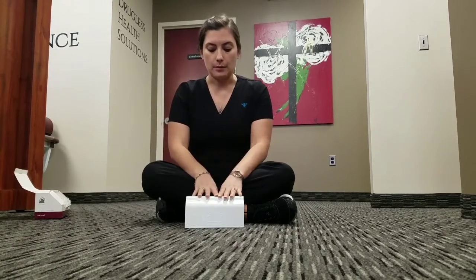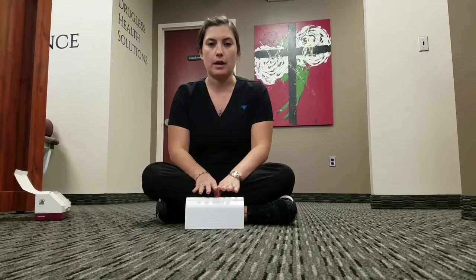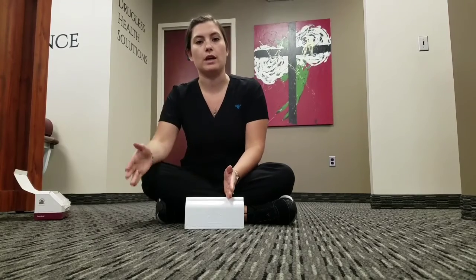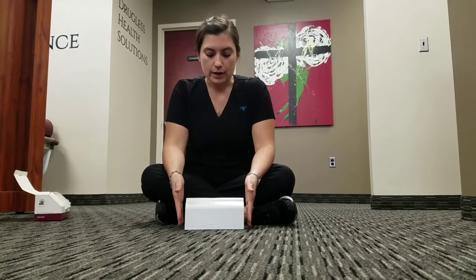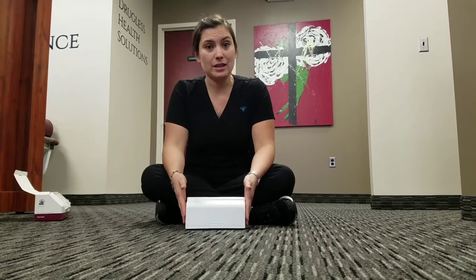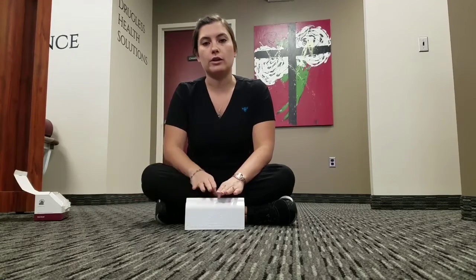Lastly, I know I said when you are increasing from 30 seconds and moving up to doing it longer, what you want to be aware of is, I know some of you already have neck pain. If you already have neck pain, all you're looking for is just making sure that the pillow isn't increasing that further or increasing soreness or discomfort further.